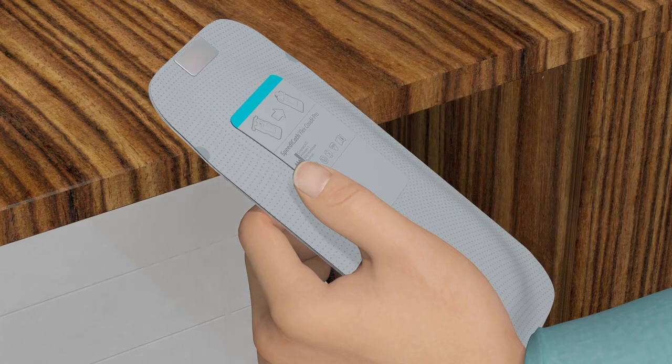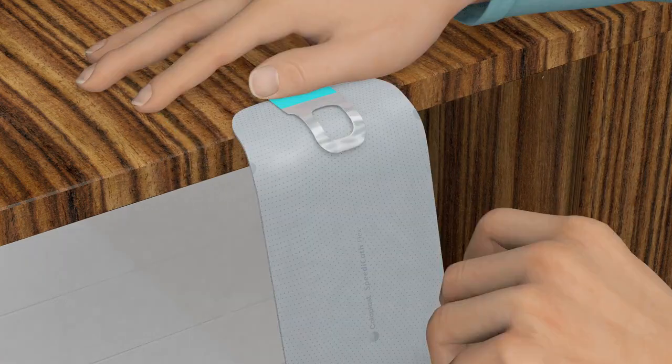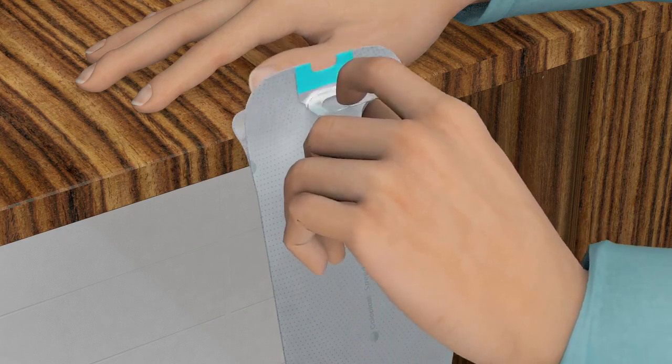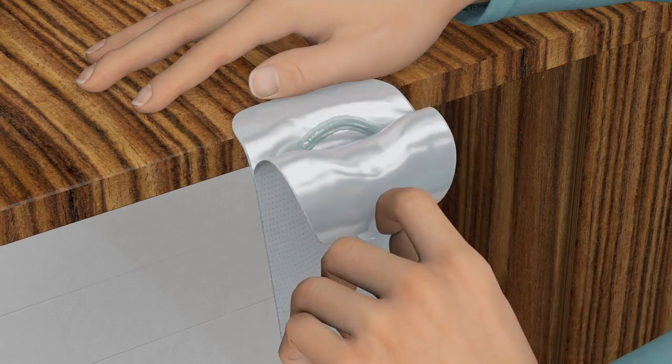Remove the cover label from the adhesive spot. Then attach the adhesive spot to a clean surface. The packaging must hang so that you can easily reach it when you are ready to use it. Open the upper end of the packaging by pulling the ring towards yourself and then downwards. You can also open the packaging without using the ring, but do not open it using your mouth. Only peel to the tear stop indicated by the 2 grey dots.